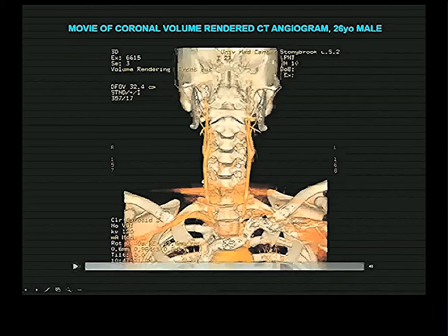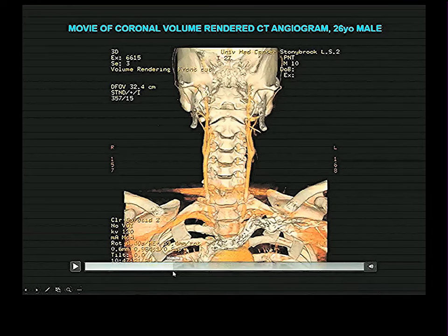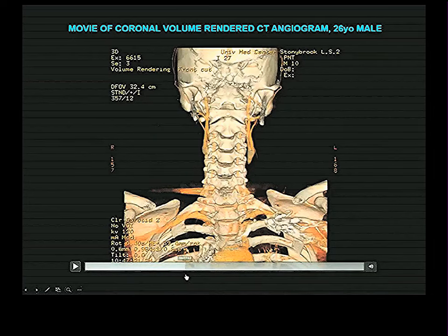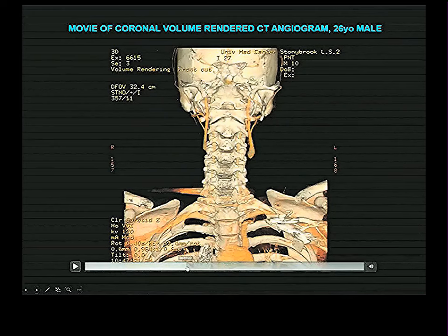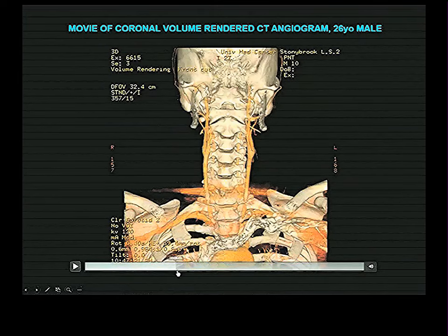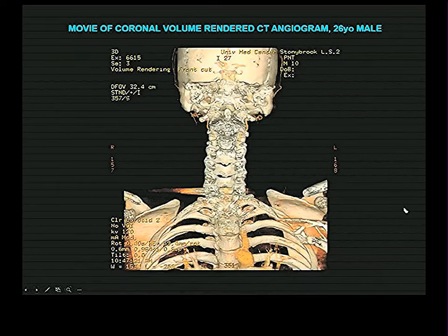And we see an artery coming up here through the transverse foramina right there on this person's left side, right here on this person's right side, and those are the vertebrals. And if we continue, see how lovely the vertebrals stand out now through the transverse foramina. You can still see them beautifully. Boy, you can see the anterior arch of the atlas right there. Even the anterior tubercle of the atlas. Expect to see the dens behind it, and we will. If we go backwards, yeah. Ugly dens. It's this thing here. It didn't come out as pretty as the rest of it.